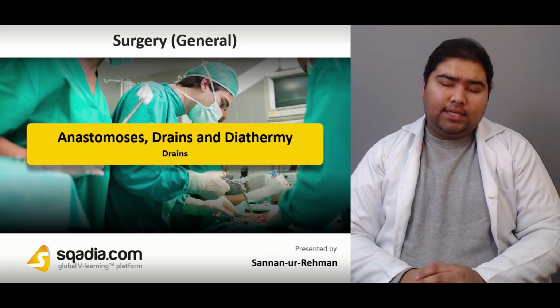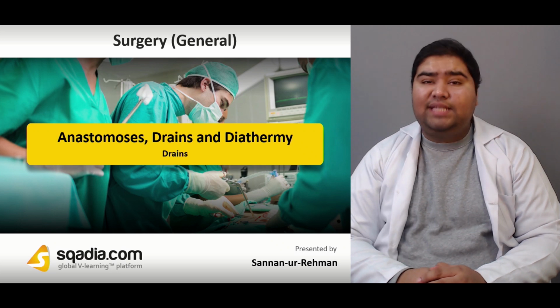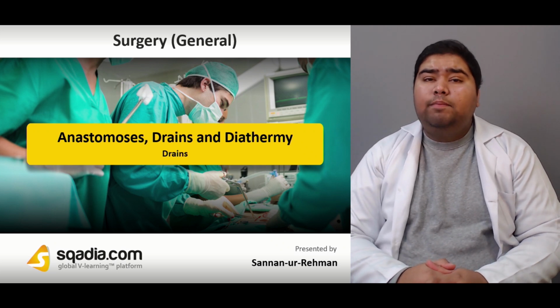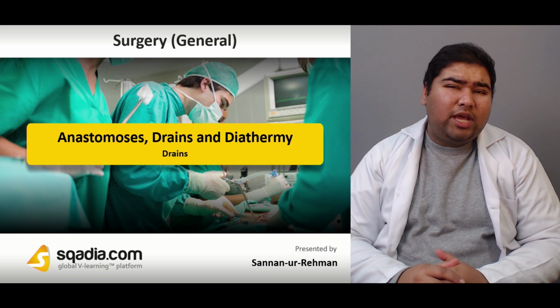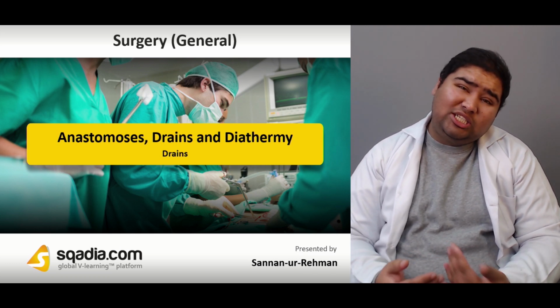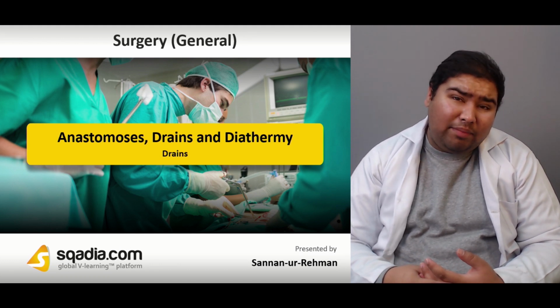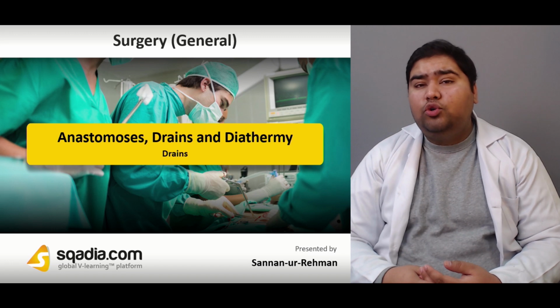You've performed a surgical procedure and now you're almost done with it. You have sealed your anastomosis, but now you just want to make sure that there's no leakage. And if there is, you want to provide a channel through which that leakage can come out of the body without harming itself. So what do you do?